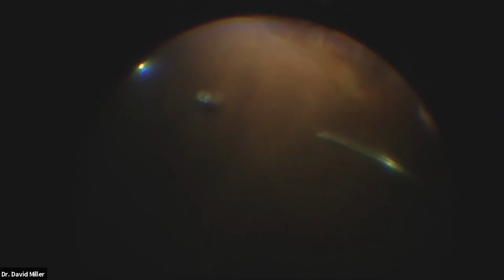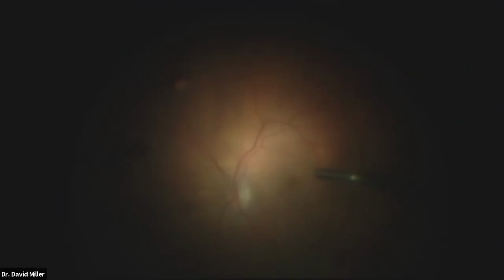So this case is not going to be too long. Now the question on this, people would say, oh, hey, should you do a scleral buckle? Should you use oil? I don't think oil is needed. I don't see enough PVR. There was some stiffness in the vitreous for sure, inferior, and we kind of cut that out, but no fixed folds in the retina.